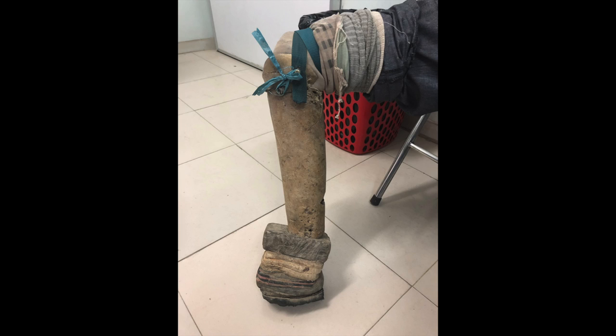This made it very heavy and very unstable to walk around in. It's always a good idea to look at the patient's old prosthetic and try to figure out what they like about it and what they don't, so that you have an idea of things to look out for as you make adjustments.